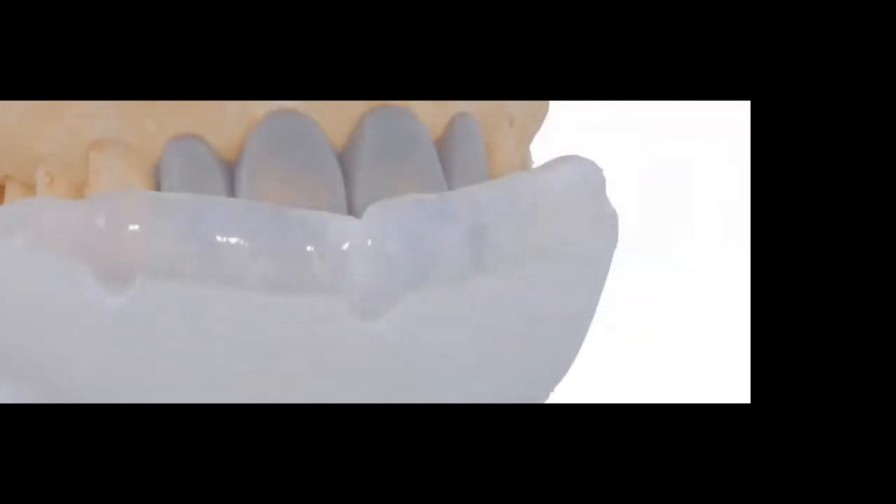Once you have the prototype, make an impression of the wax-up using clear PVS. I fabricate a custom tray — a triad tray — inject the clear PVS, and make the impression, always extending to other teeth for positive seating. The most important thing: when doing your wax-up, make sure you create very nice facial and lingual embrasures. This allows very little removal of excess in the patient's mouth when you deliver the prototype.